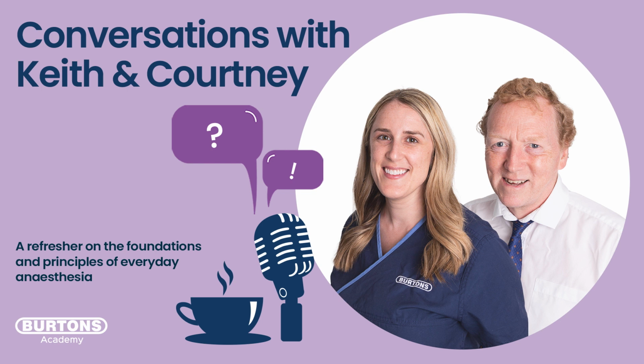So we're starting to get there now, because it doesn't matter what ventilator you approach, unless we're talking about something called pressure control ventilation, which I don't want to get into at the moment. I want to talk about volume control ventilation for all of these. So volume control ventilation is where air flows into the patient at a continuous rate normally.